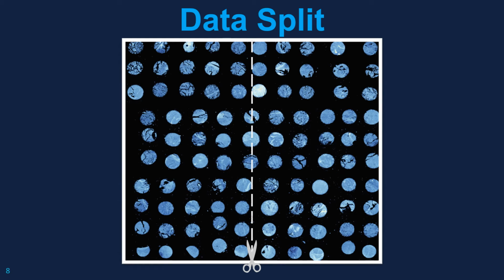Originally, we used a random data splitting function for the test-train split. After initially training on our labeled data, it became clear that there was some overfitting going on with some of the classical models. To better validate our models, we effectively cut our dataset in half spatially. Data on the left half of the set is used for training, while data on the right half is used for testing. This allows us to more effectively evaluate models and is more similar to a clinical scenario.